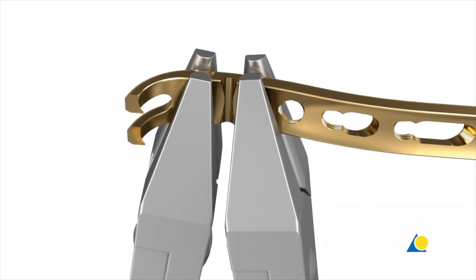The shaft contains LCP combi holes that accept either 2mm locking or cortex screws. The undercut helps to ensure that the threaded holes will not be distorted with typical contouring.